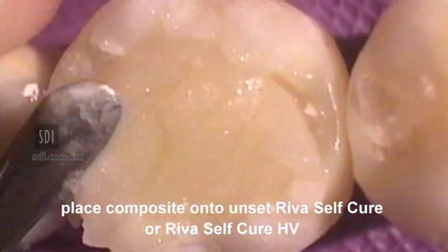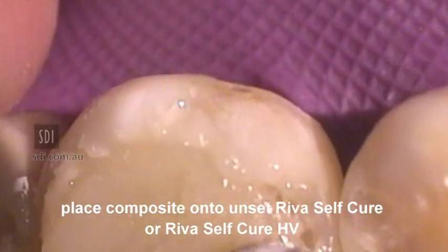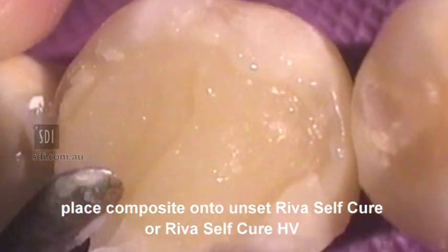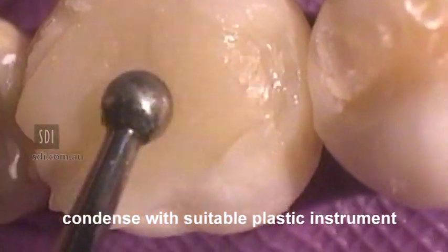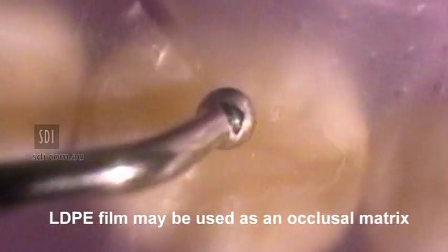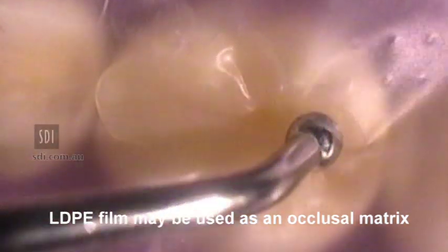Place a suitable composite resin into the preparation and condense to slightly overfill. Commence condensing with a suitable plastic instrument. Condensation may be facilitated by placing a plastic film over the preparation and continue condensing.